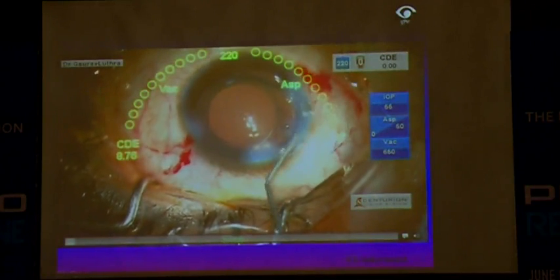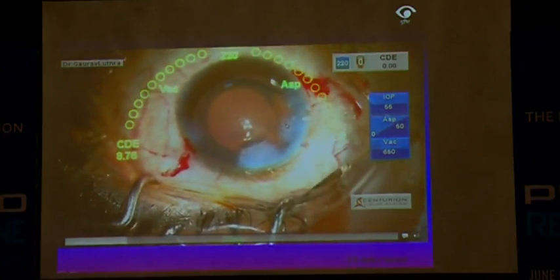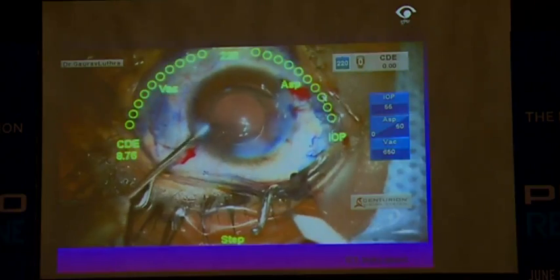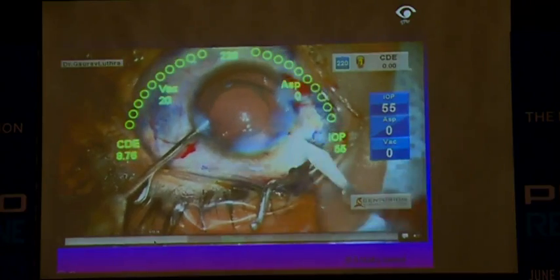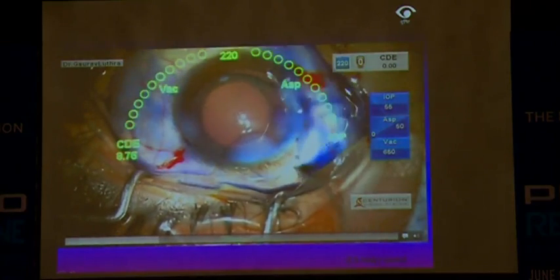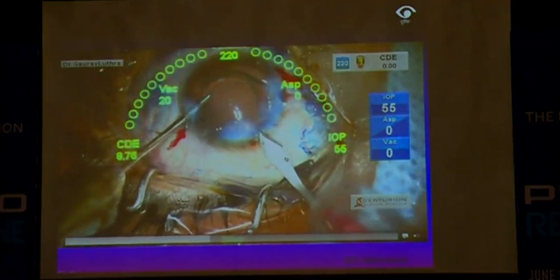Now, sometimes these incisions being slightly larger than usual, you will have incisions which may be leaky, especially if you've had a stuck ICL. Now, you can see this is a nice, cool way of checking for that. I just put a few drops of Trypan Blue, and that will immediately show. If you watch that again, you can see the flow of fluid from here, and you immediately know which of your wounds is leaky, and then you can go and make a supra-incisional tunnel.